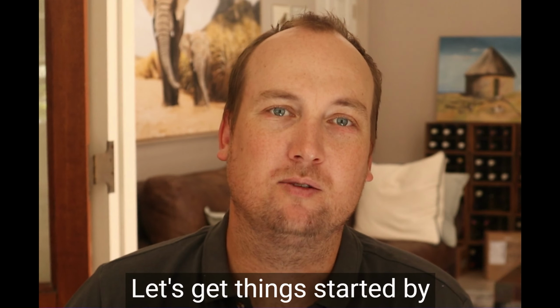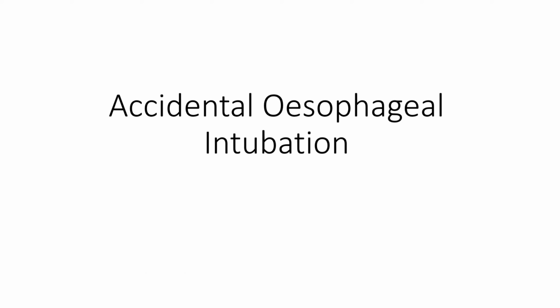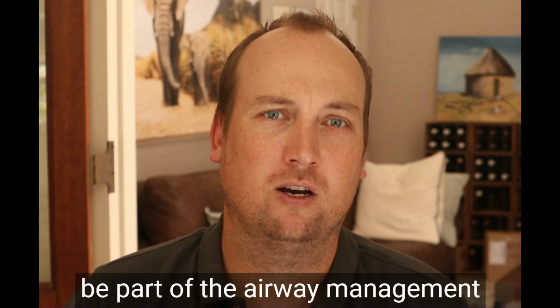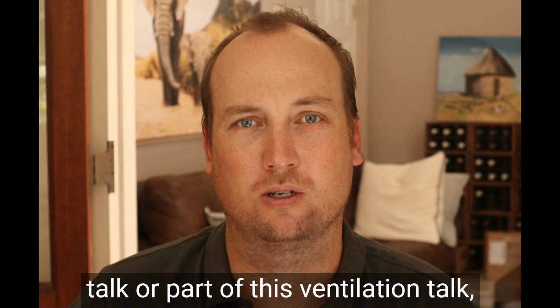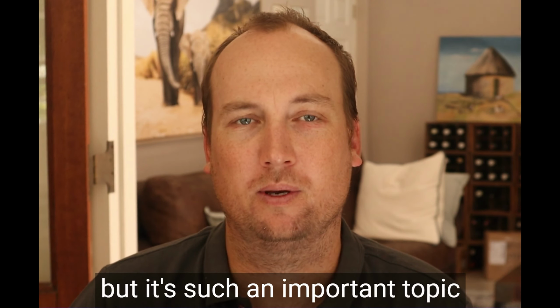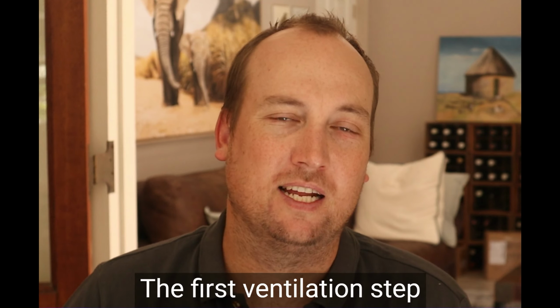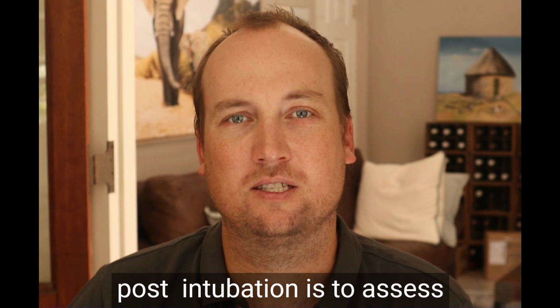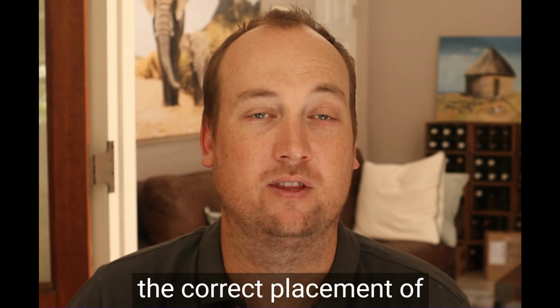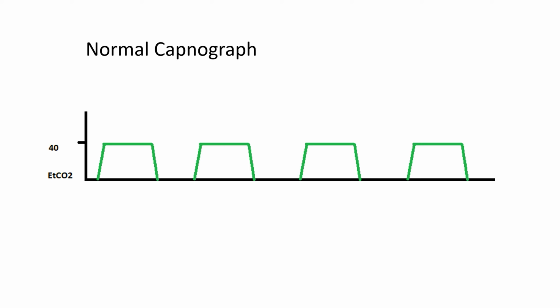Let's get things started by looking at esophageal intubation. I'm not sure whether this should be part of the airway management talk or part of this ventilation talk, but it's such an important topic that we're going to cover it in both. The first ventilation step post-intubation is to assess the correct placement of the endotracheal tube. And waveform capnography is the gold standard for this.